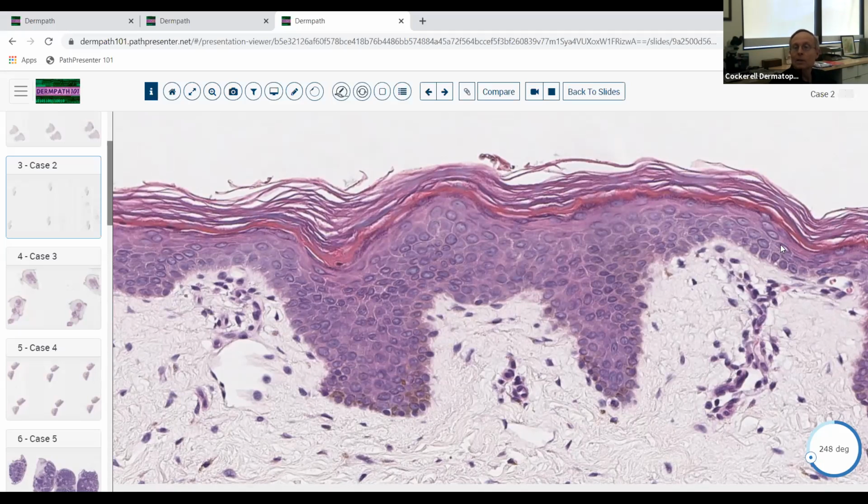If they put things in there like allergic contact dermatitis, that really wouldn't be the best diagnosis here. If they put nummular, or an acantholytic process, say Grover's disease or something like that, none of those would be very good answers. If they put asteatotic dermatitis or xerotic dermatitis, that would be the best answer, because that's actually what you see when you biopsy asteatotic dermatitis.